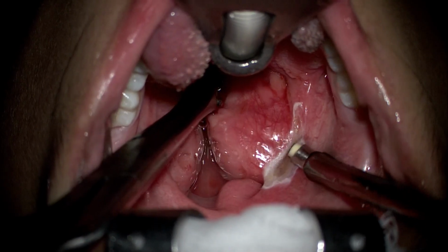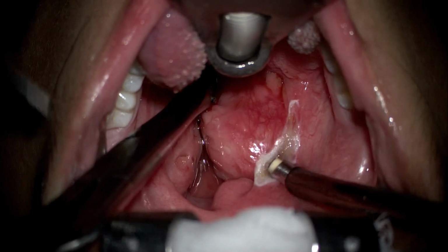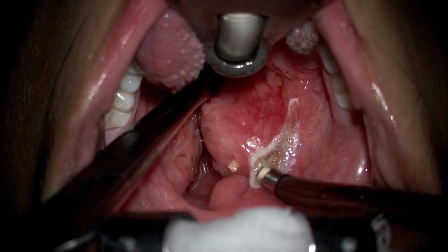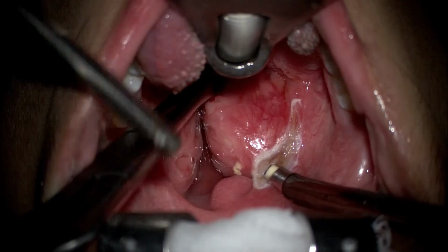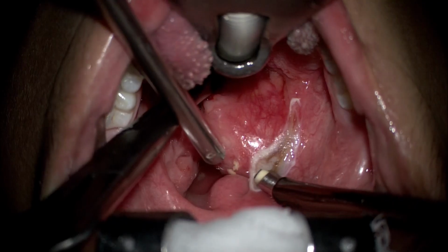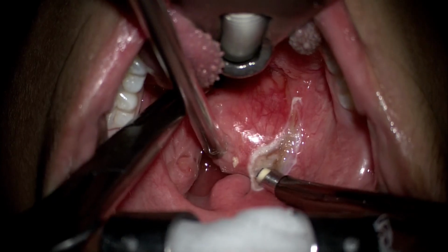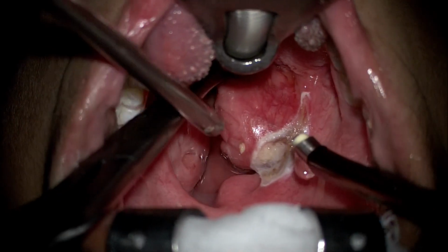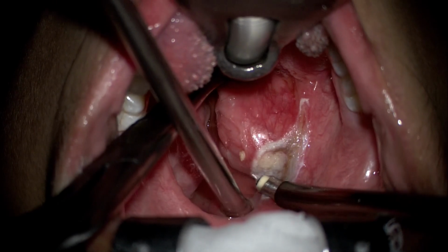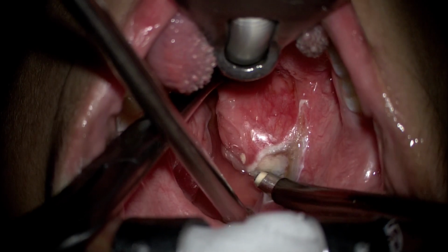As you see, the first point is to use the coblation wand on ablation mode and to define the correct plane of the tonsillectomy, the plane between the lymphoid tissue of the tonsil and the connective tissue, while taking care not to unnecessarily expose or ablate the musculature inside the tonsillar bed. So here one can initially show some patience and spend some time in identifying the right plane, because once the right plane is identified, the rest of the surgery becomes much more straightforward.